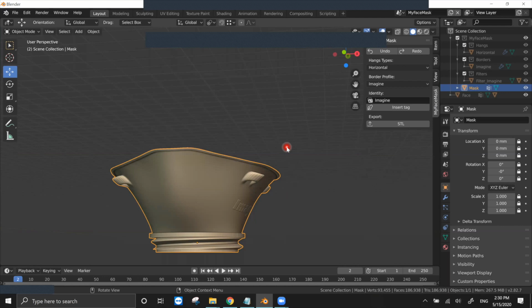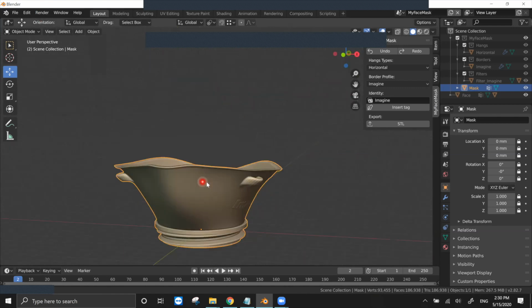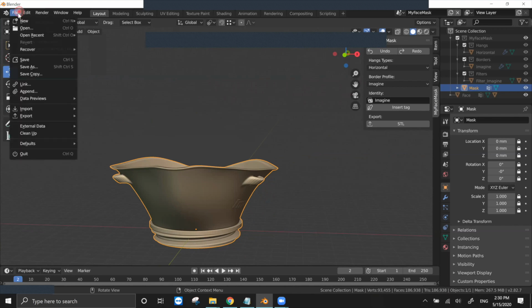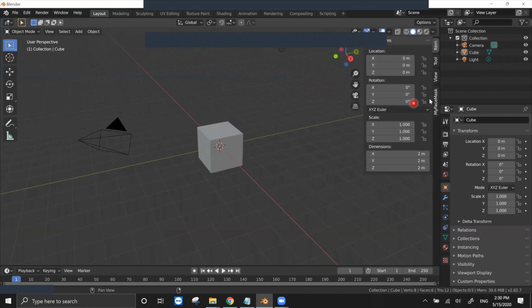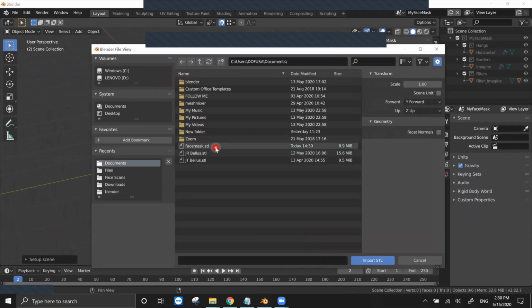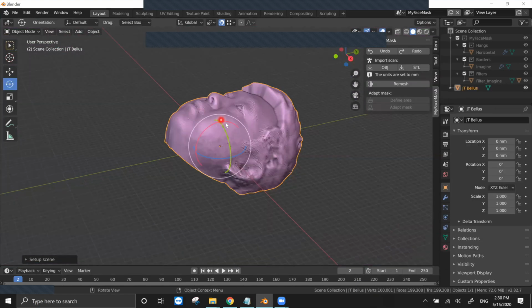And again, Josh emphasized that feasibility was one of the main factors that we were focusing on when making this, and also how quickly you can actually make this. So if we start over and keep all the defaults, you'll notice that everything can be done pretty quickly. I'm just going to go back into my face mask, import his face again.